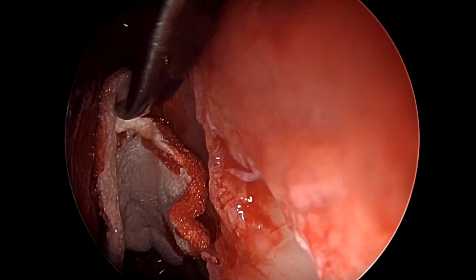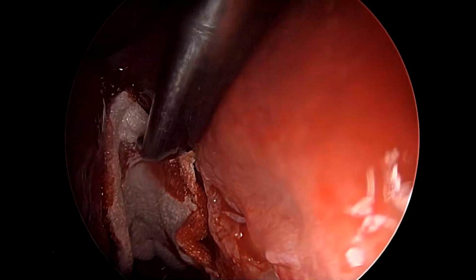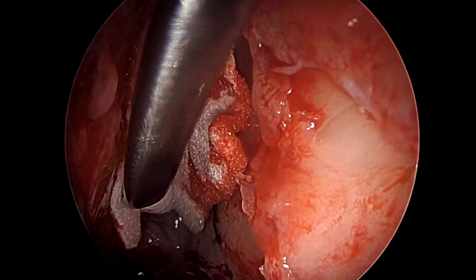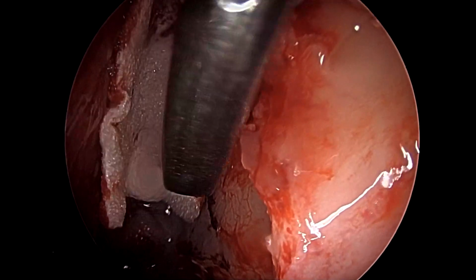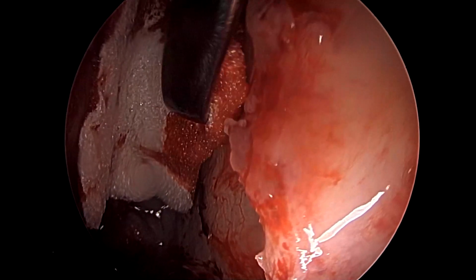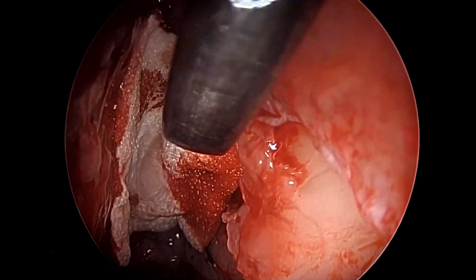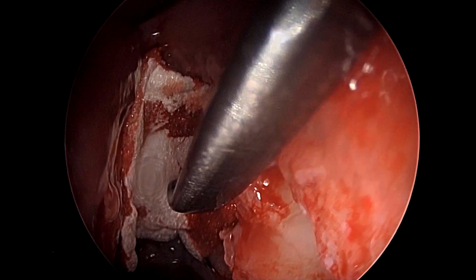Gel foam also, one must understand, induces fibrosis when it is in contact with the mucosa, which in this situation appears to be good and handy and to our benefit. In normal sinus surgery, we abstain from using gel foam, again because of its fibrosis-causing properties. Here, in situations of closure of skull-base defects, fibrosis comes to our rescue, as it would help in creating a more enduring repair of the leak.